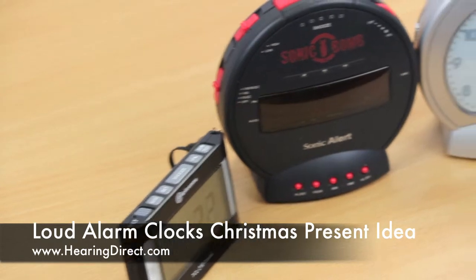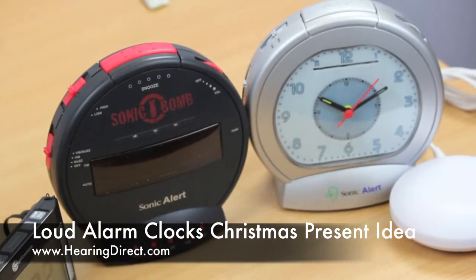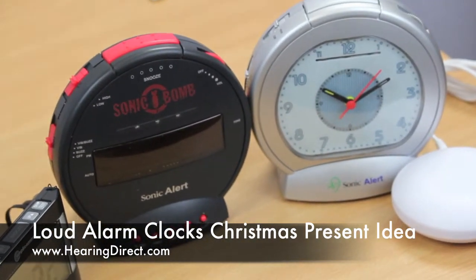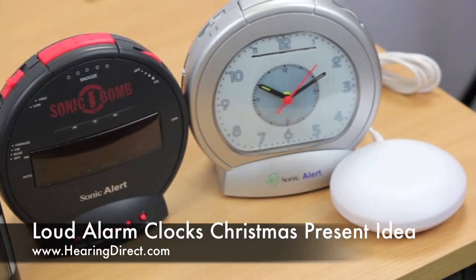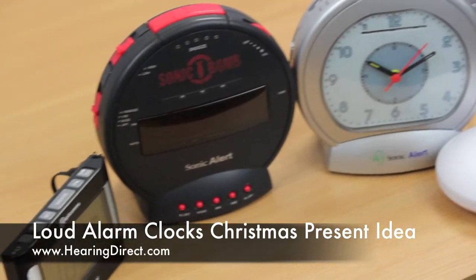The bigger alarm clocks that are meant for bedside tables, they do require mains supply, so it's important to realise that they will need their own plugs. The travel alarm clocks operate simply from batteries.